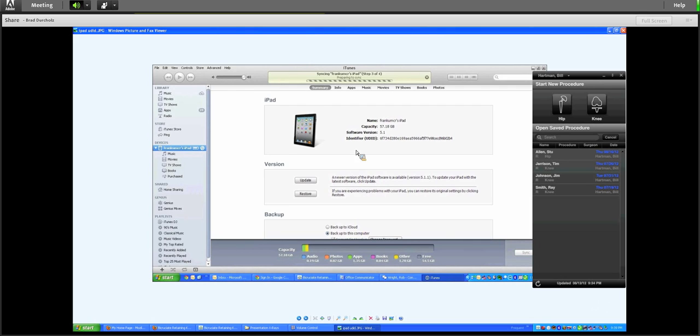One thing that you can't see, because this isn't live, it's just a screenshot: if you click right on the identifier UDID, it switches between the UDID and the serial number. The first thing it's going to show you is the serial number. We also need that number, so you'll have to send us both the serial number and the UDID number. That's just so we know which iPad it's on, and nobody can have the software without us knowing about it.